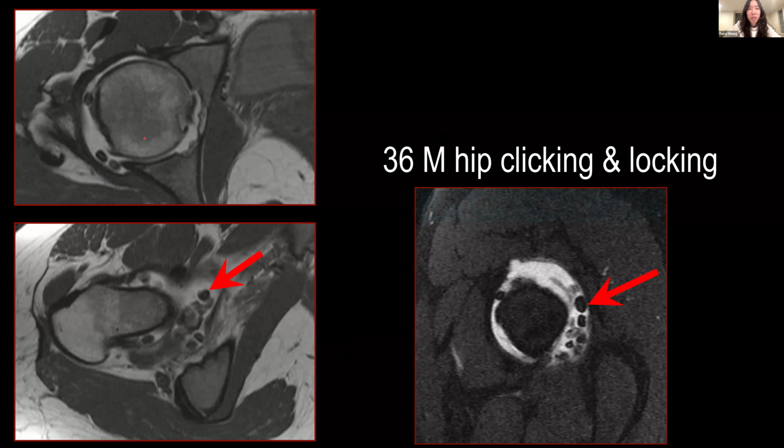Thank you, Dr. Boutin. That was great. Lots of interesting examples in there. We have a question from Hunter. Could you comment on objective things you look for, on measurements you look at, when assessing FAI on X-rays?